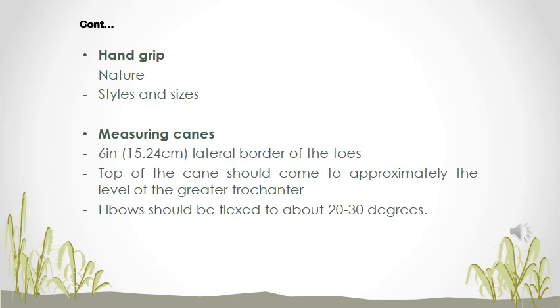But when you measure a cane, be sure that you use the following points to measure it for your exact individual patient. So it should be 15 centimeters to the lateral border of the toes.